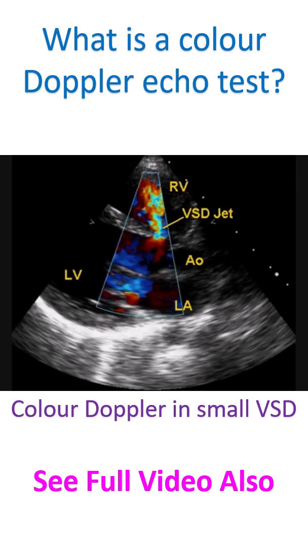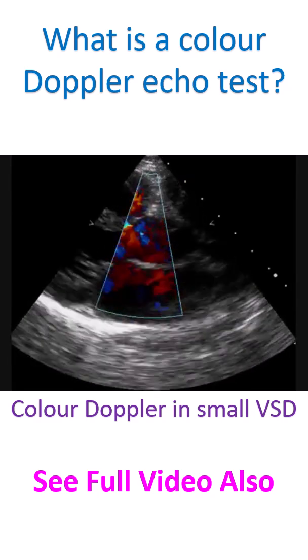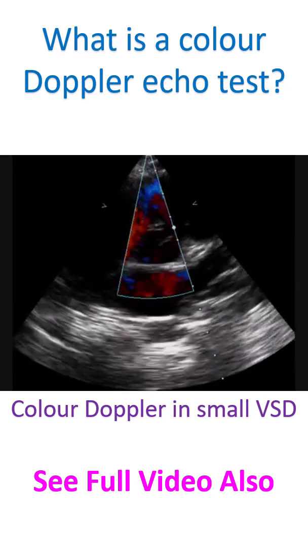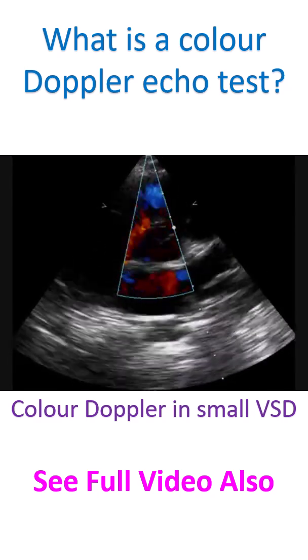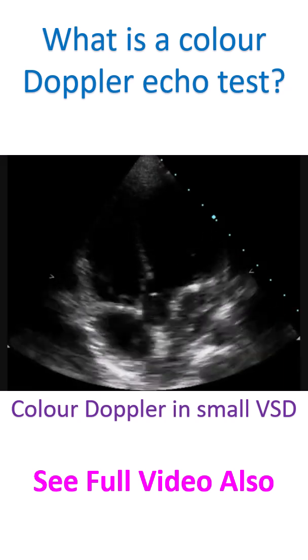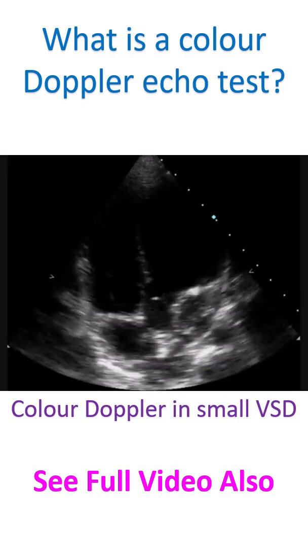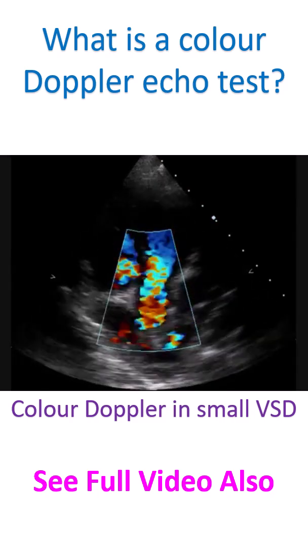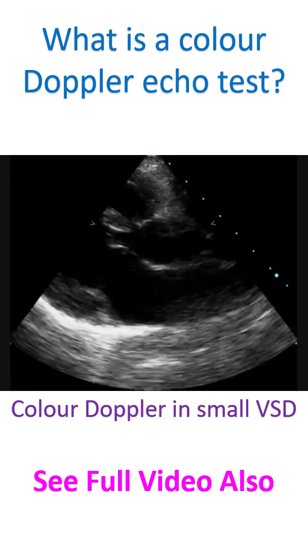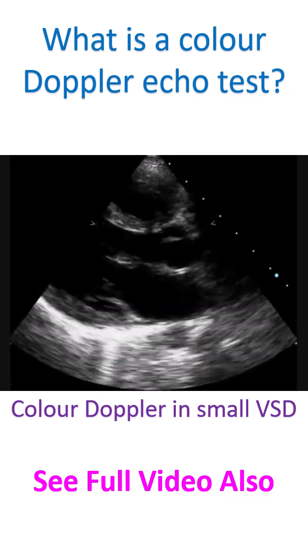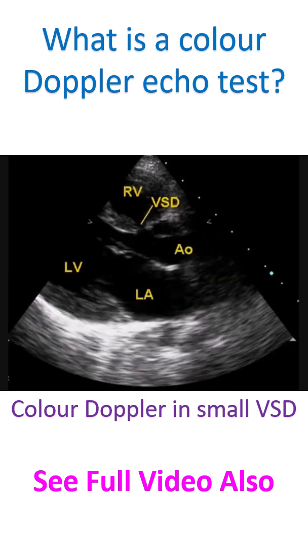Mosaic colored jet on color Doppler is easily seen. For example, when the defect between the two lower chambers — VSD — is small, the pressure difference between the right and left ventricles is high. This produces a turbulent high-velocity jet which can be easily seen on color Doppler.